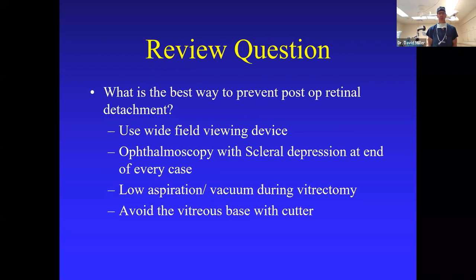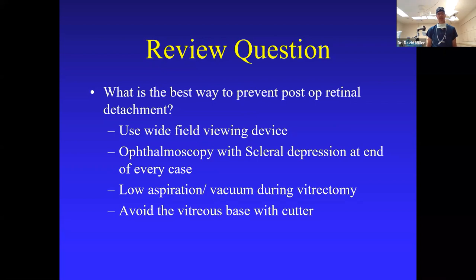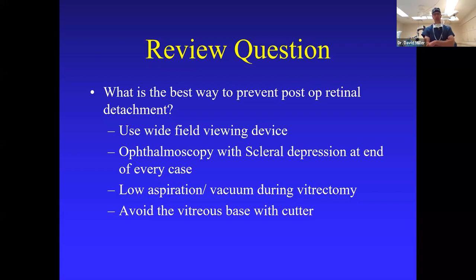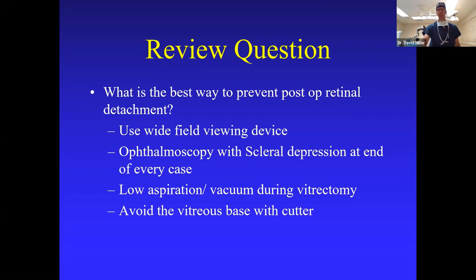What is the best way to prevent post-op retinal detachment? One of the biggest fears in retinal surgery is always post-op complications. The choices are: use of a wide-field imaging device; ophthalmoscopy with scleral depression at the end of every case; low aspiration and vacuum during vitrectomy; and avoid the vitreous base with the cutter. I'm looking for the best single answer to lower your risk of post-op retinal detachment. Answers are a little split — we'll cover those points during the case.